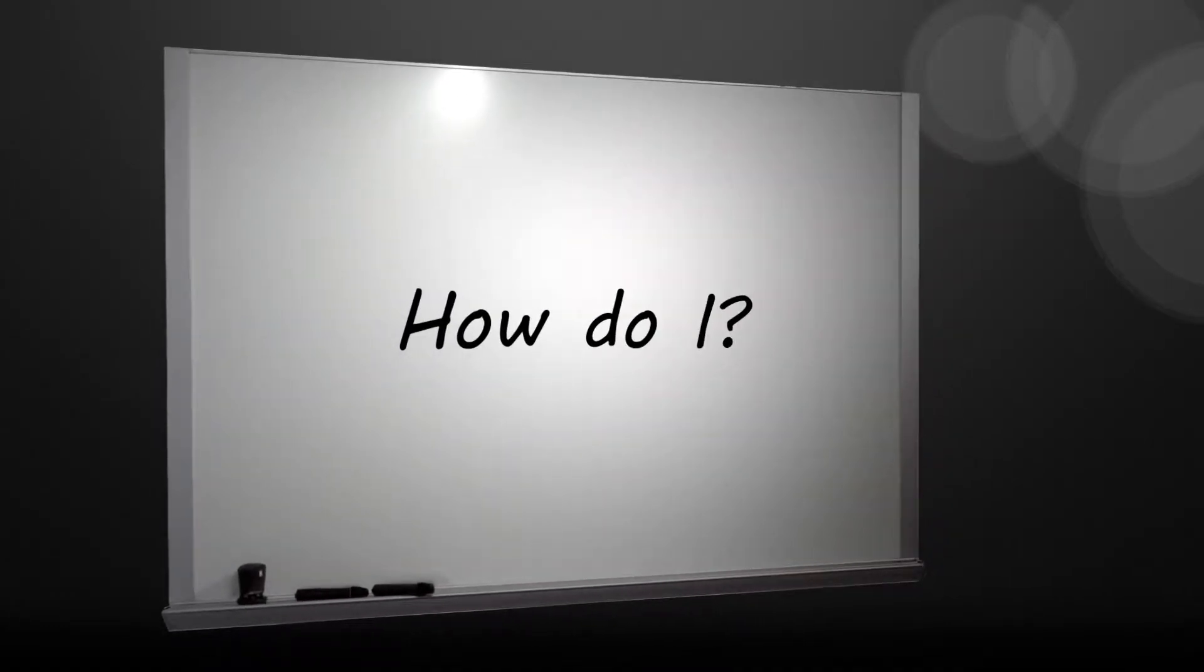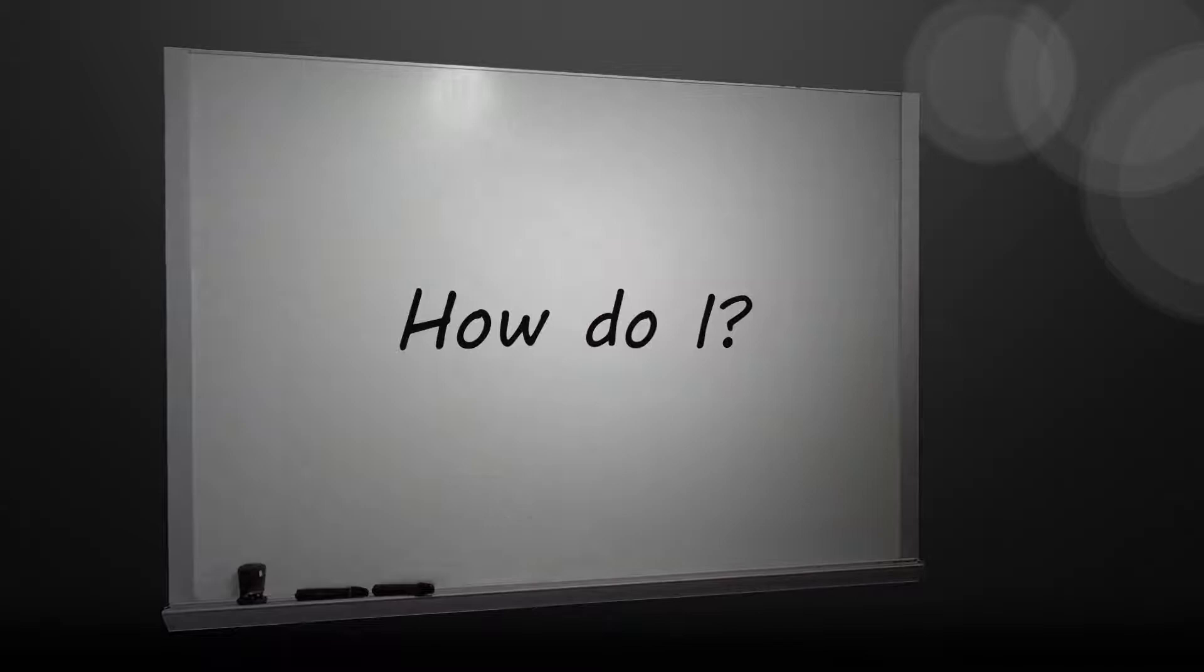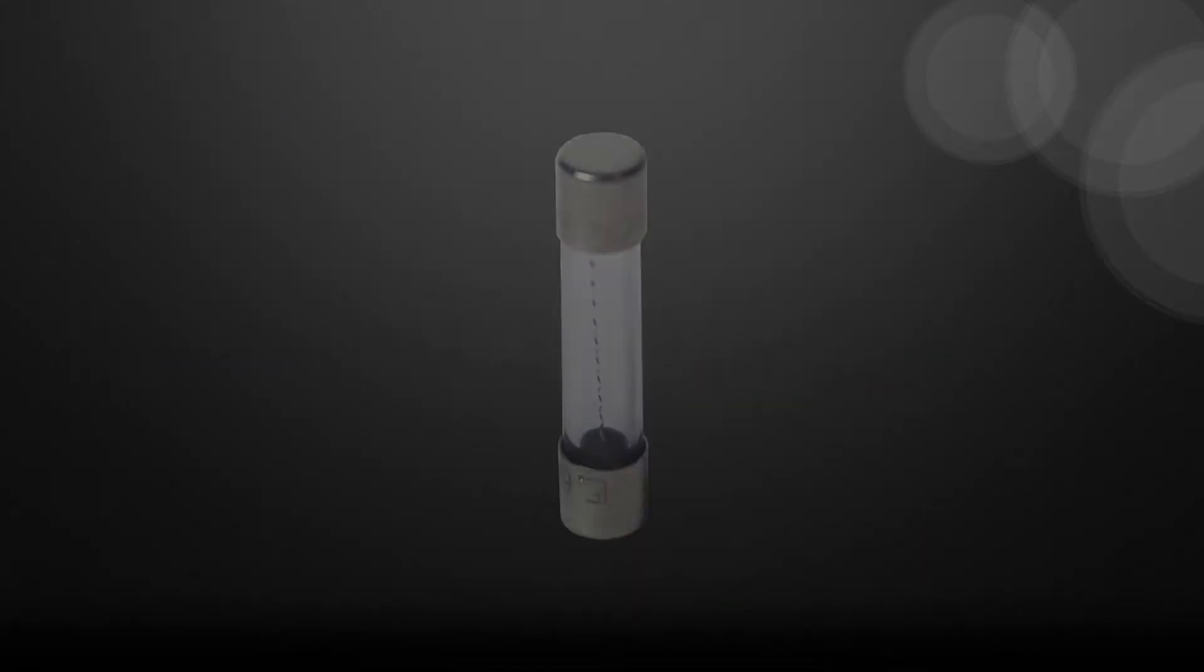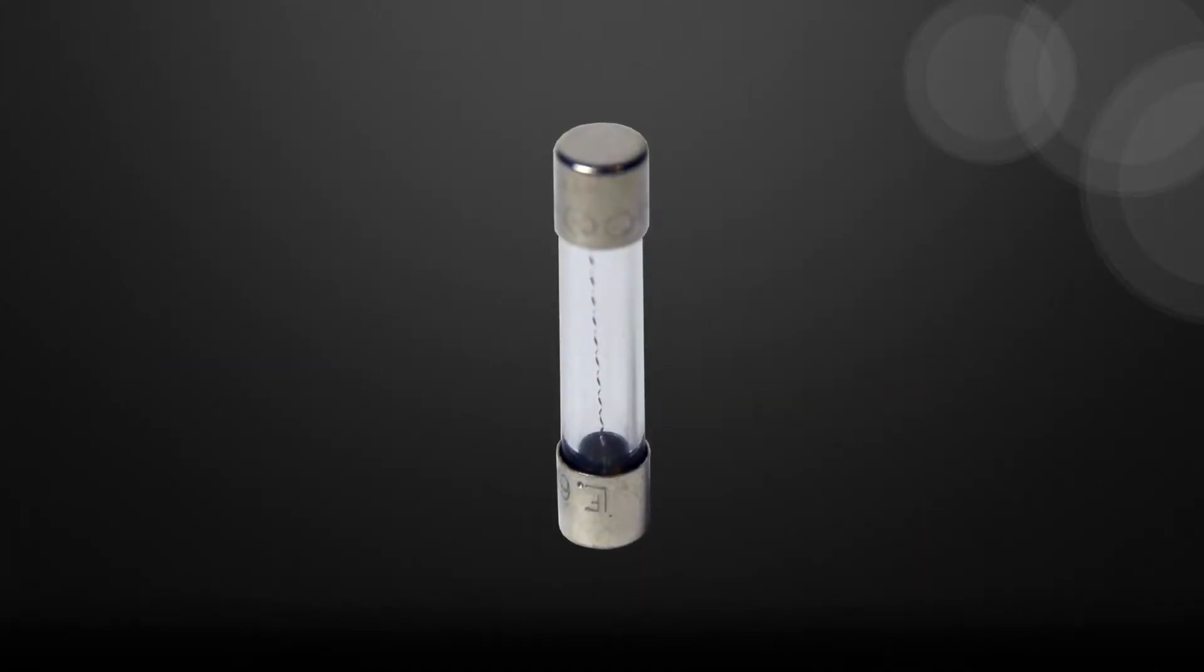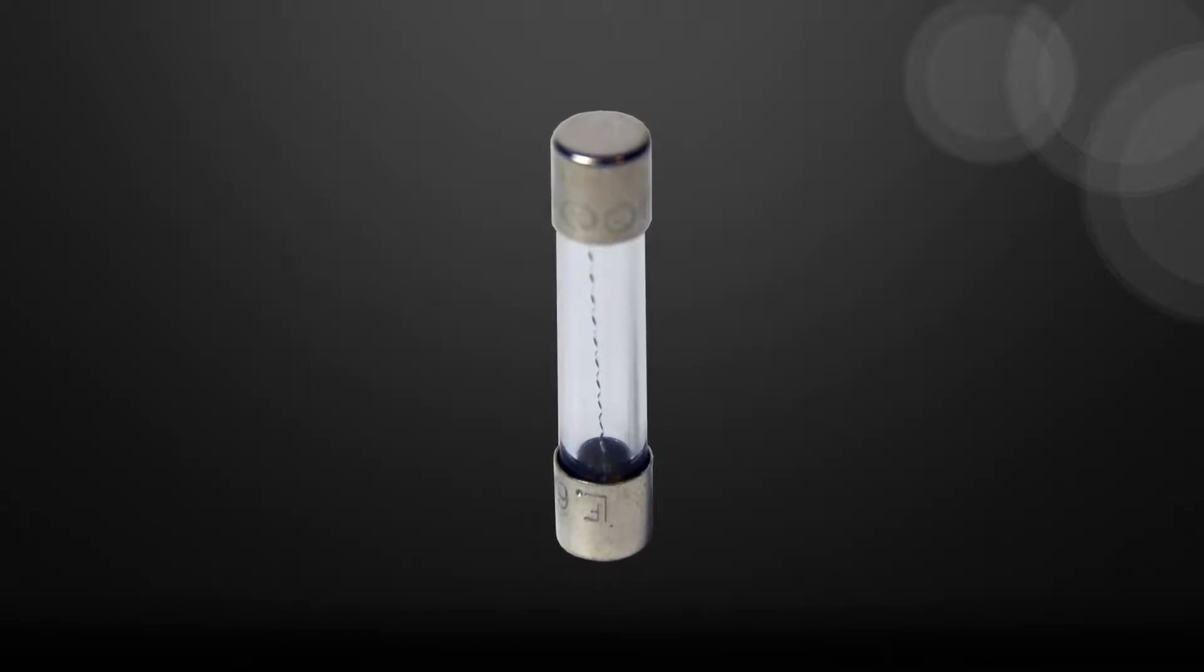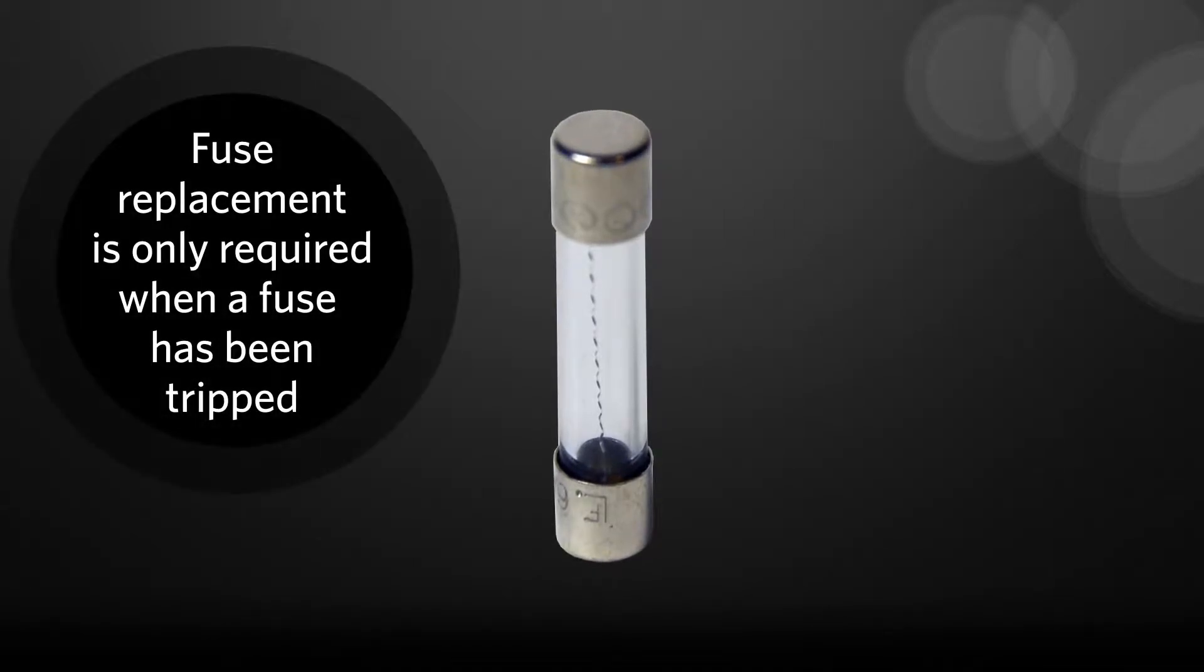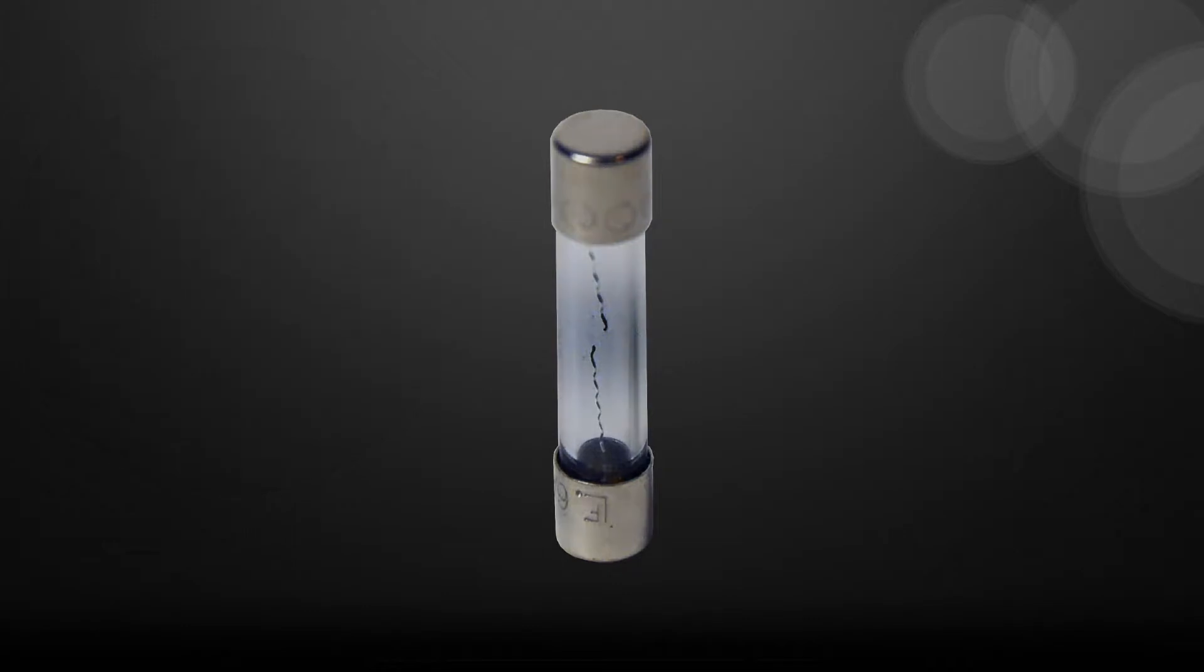How do I replace the fuses on the FlexMap 3D? Let's take a look at the procedure for removing and replacing the fuses on the FlexMap 3D. This process is only required if a fuse is tripped.